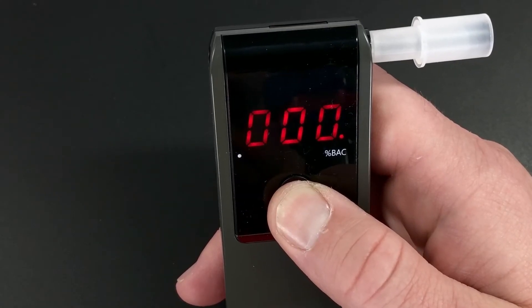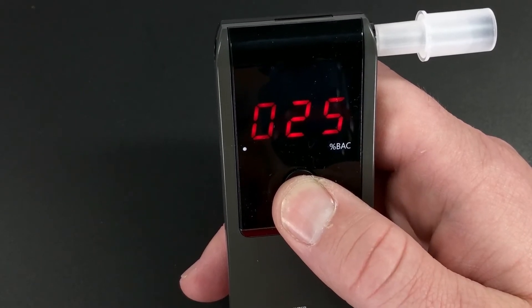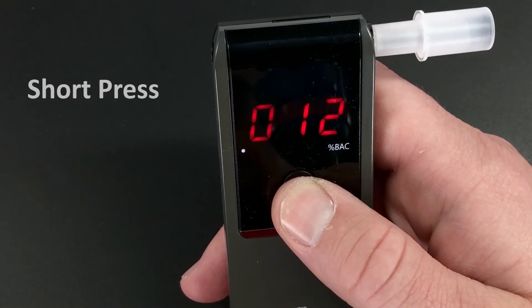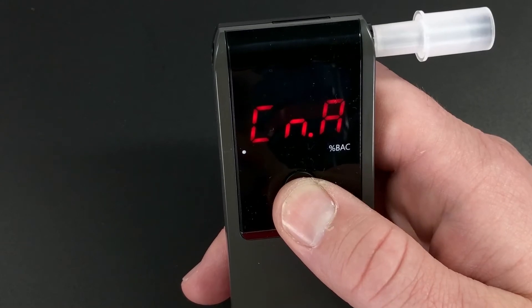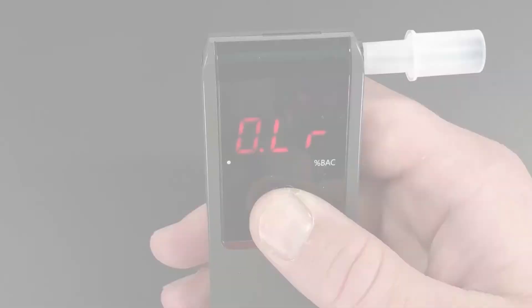To see how many times the unit has been tested in total, short press the on button. Here you'll see it's been used 25 times in total. Finally, single press again to see the number of times the unit has detected a positive blood alcohol level. You'll see CNA displayed and read 12 — this means that the unit has tested positive 12 times in total.